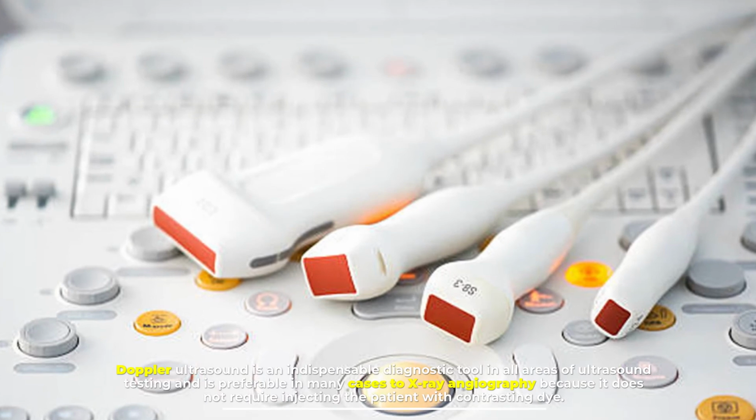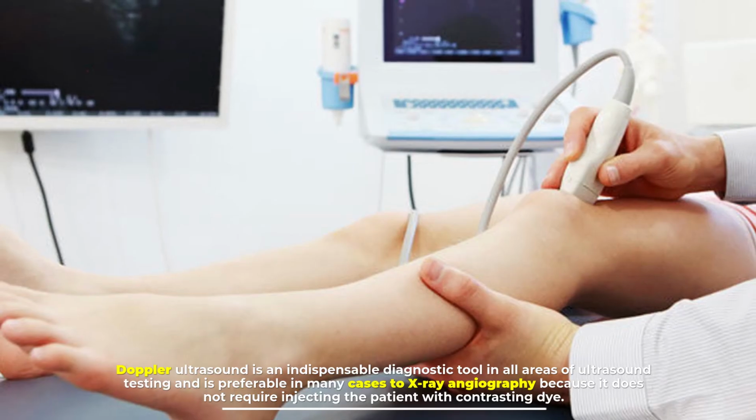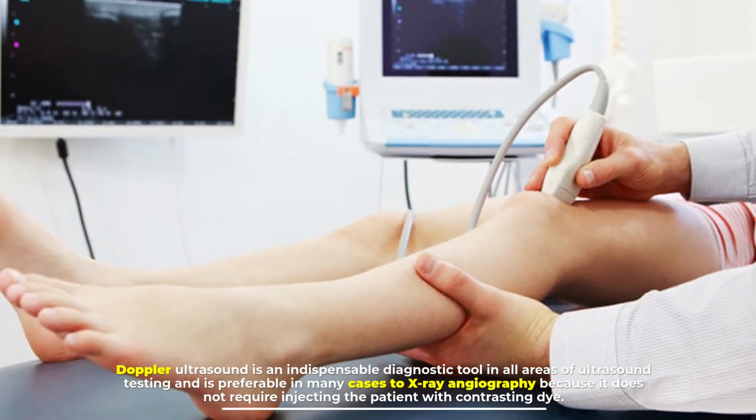Doppler ultrasound is an indispensable diagnostic tool in all areas of ultrasound testing and is preferable in many cases to X-ray angiography, because it does not require injecting the patient with contrasting dye.